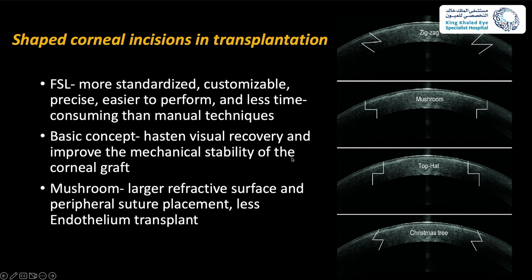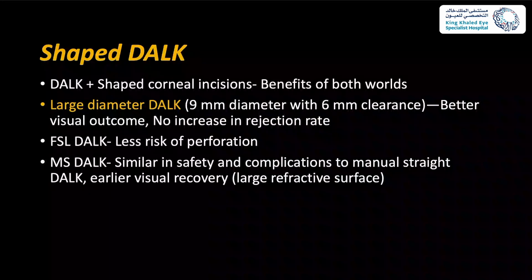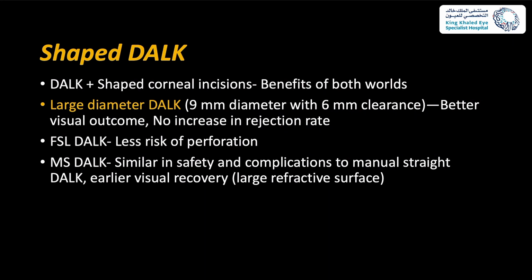Okay, so what about shaped DALK? Can we get shaped DALK? Can you do mushroom shaped DALK or a top hat DALK? Definitely you can, but the results are still not compelling. Then can you do something else with the femtosecond to improve DALK? Definitely you can do your lamellar cut, at least to get a deeper cut.